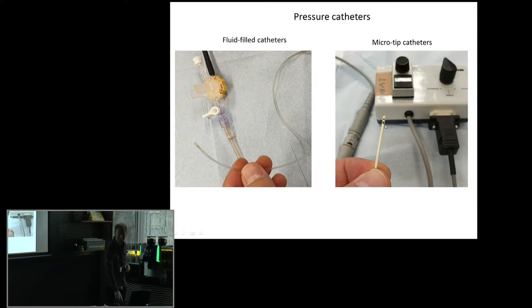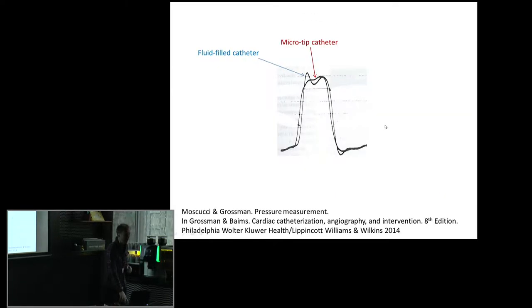One comment. The fluid-filled catheter also creates a delay because it's dependent on the length of the tube. Yes, so there's also a delay in the signal. Yes, I forgot that point. You want to keep it as short as possible. Is it only delay or also damping? Also delay and damping. And also these bubbles.